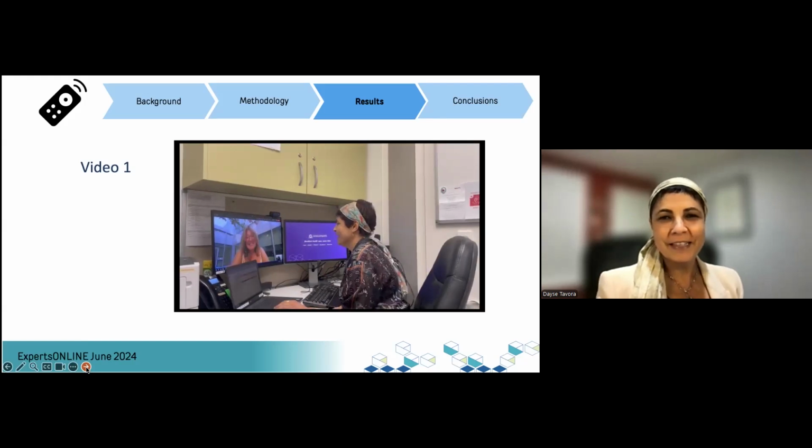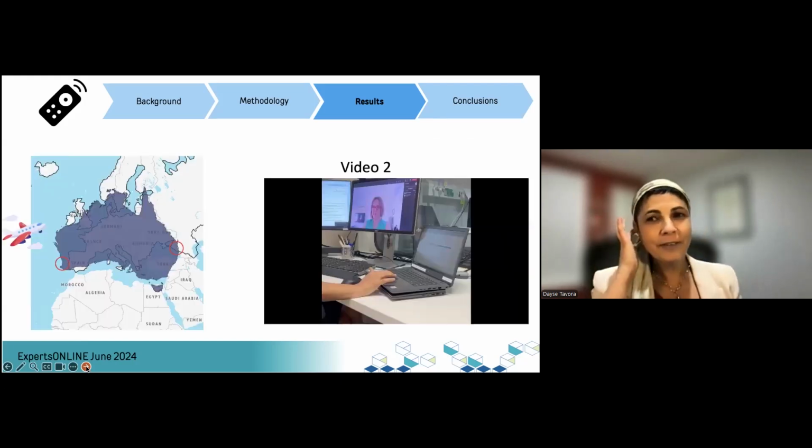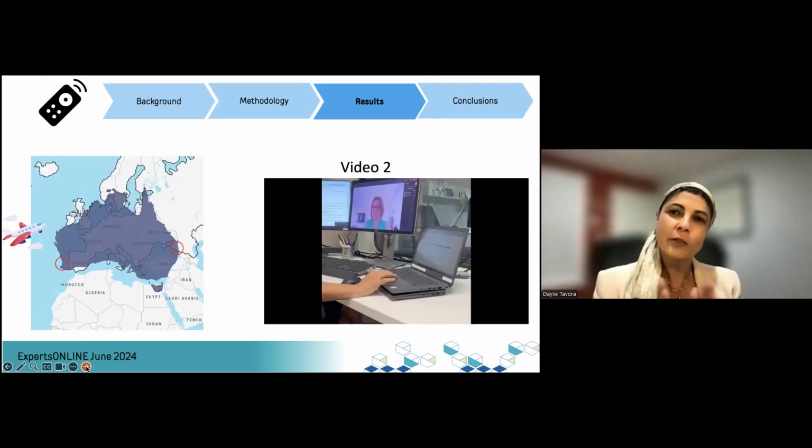Okay, so in this video, the reason why I played it all, it could be a little bit boring for some, but it was just to show you that it is actually the real time. The editing was just cutting from one camera to another. It is definitely very quick. So as soon as you say send, the patient will take a few seconds and the patient sees on the screen that it is available. So for us it works really well because we can do this within the appointment time.